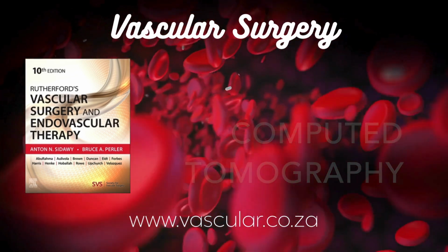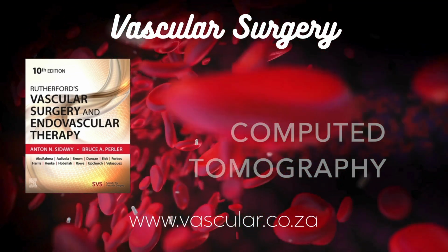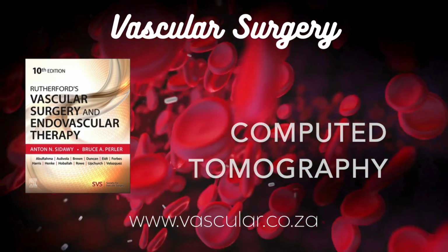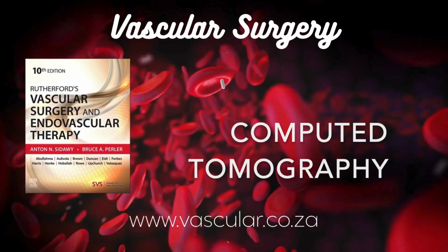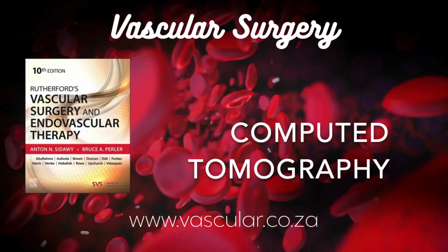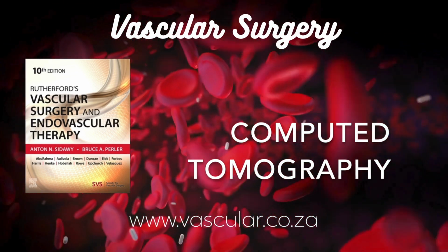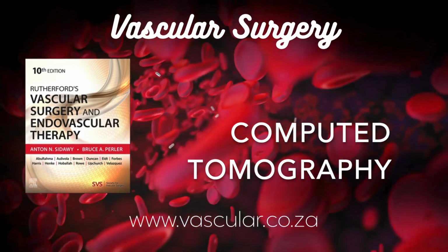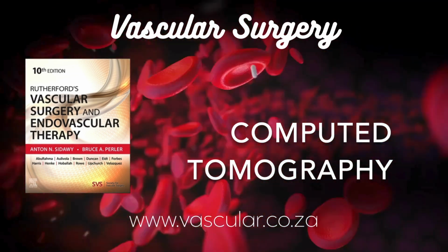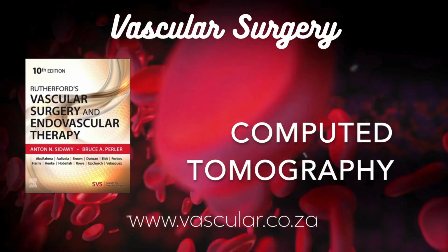You also mentioned volume measurements earlier. How do those fit in? That's another powerful application of 3D models. Instead of just measuring diameter, you can calculate the total volume of an aneurysm sac, for instance. Why is that better? Studies suggest volume changes can be detected earlier and more reliably than diameter changes, especially after endovascular aneurysm repair, EVAR. An aneurysm might not get wider, but if its volume starts increasing, it could signal a leak, an endoleak that needs attention.